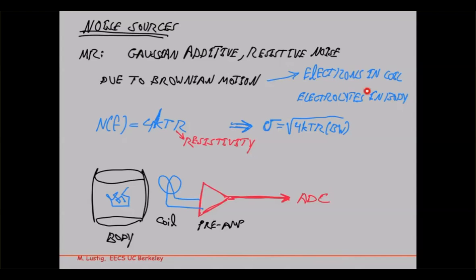And the noise then is Gaussian. That is not true, for example, in optics or other regimes where noise can be Poisson, and then often people approximate it as Gaussian. But MR signal is really corrupted by Gaussian noise. It doesn't necessarily have to be white Gaussian, but it's definitely Gaussian, to a very good approximation. It's a true Gaussian process.